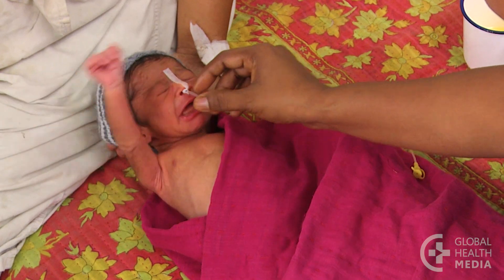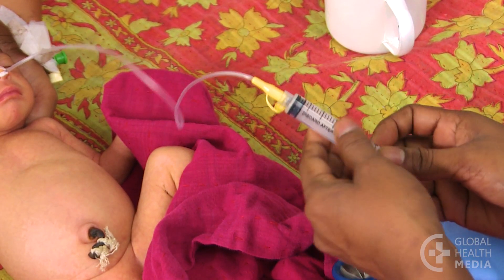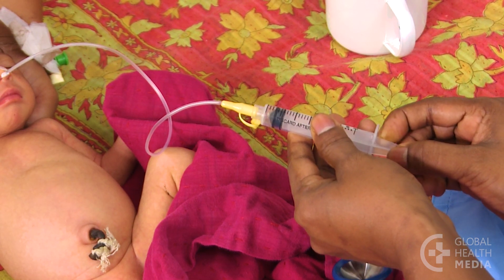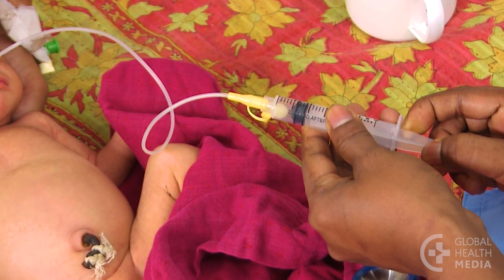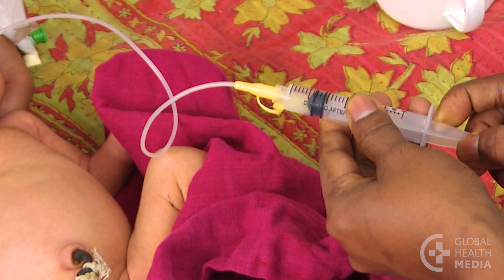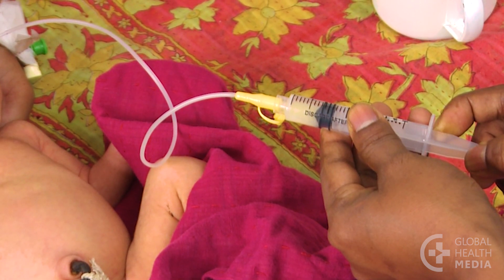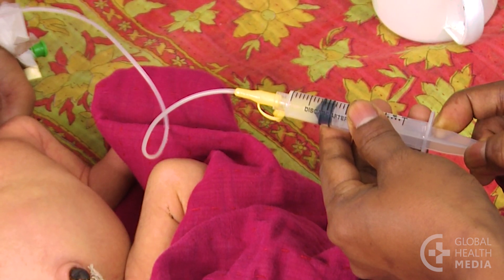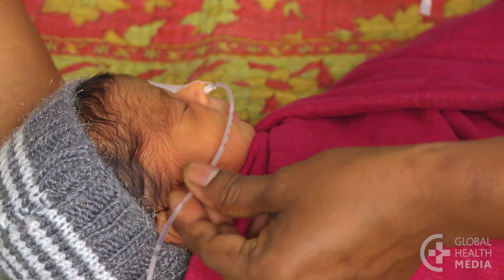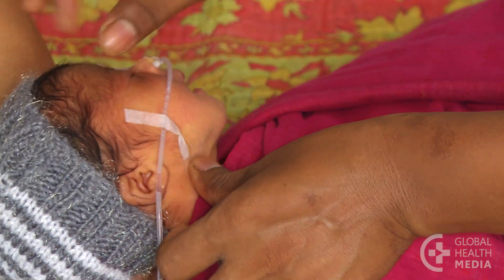Now check for correct placement: connect the syringe to the tube, pull back on the syringe, and look for small amounts of digested milk or gastric fluid in the tube. If there is no fluid in the tube, remove it and repeat the procedure. Tape the tube securely once you've confirmed it is in the right place.